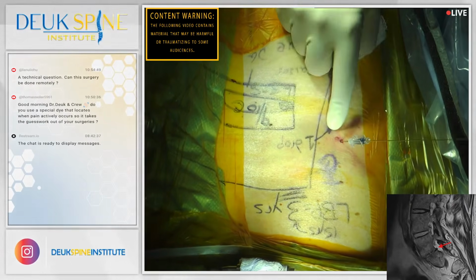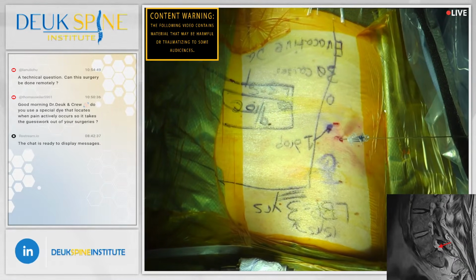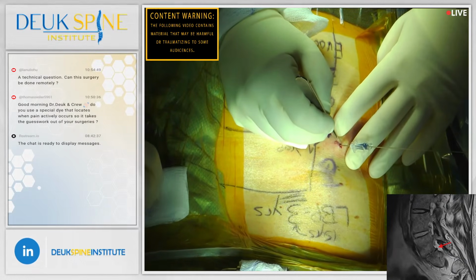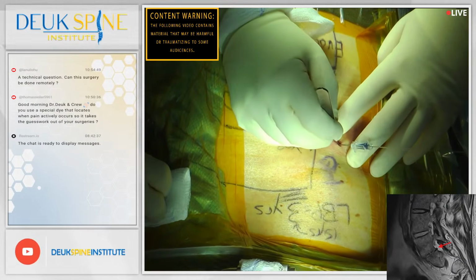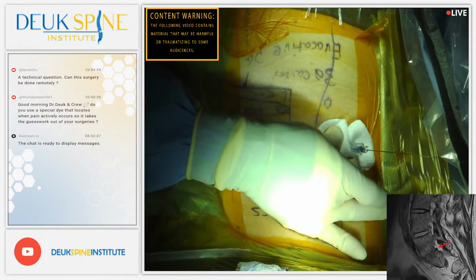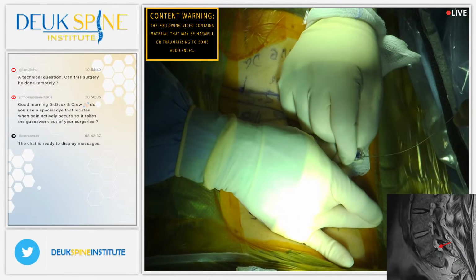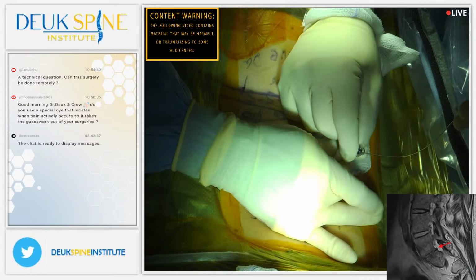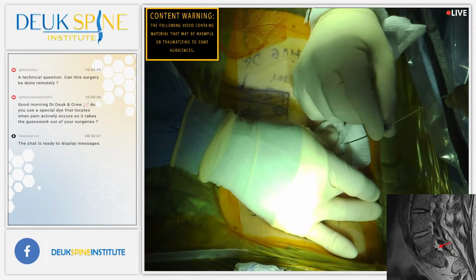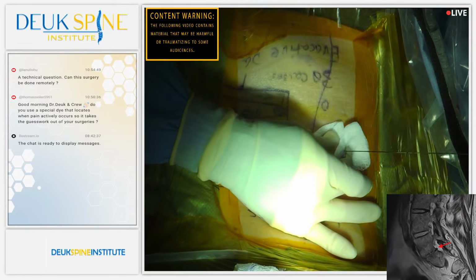By the way, we've lost 1 drop of blood. Literally 1 drop of blood this whole surgery so far. That's this procedure. You don't need to have invasive surgery. Don't have fusion anymore. Don't have discectomy. Don't have laminectomy. Those are old surgeries that don't work. They never cure back pain or neck pain. And more importantly, they're unnecessary, and everything they do can be done here with the laser procedure when it comes to symptom relief.